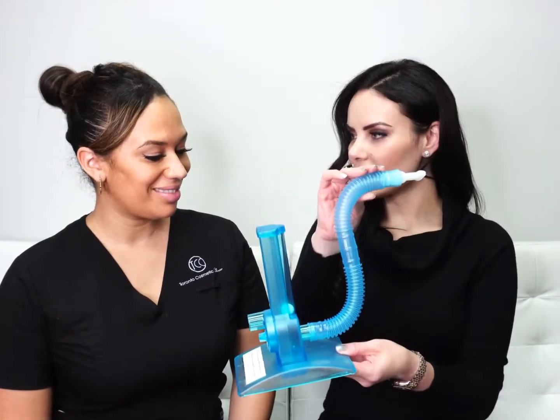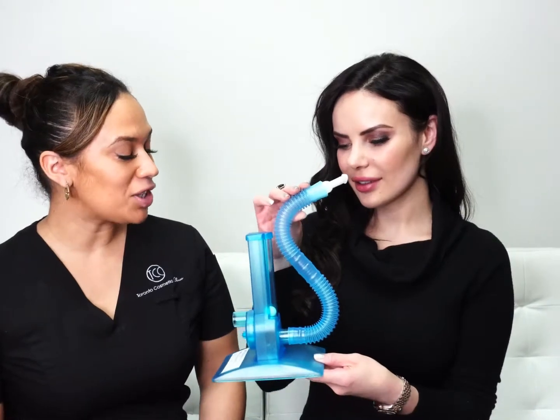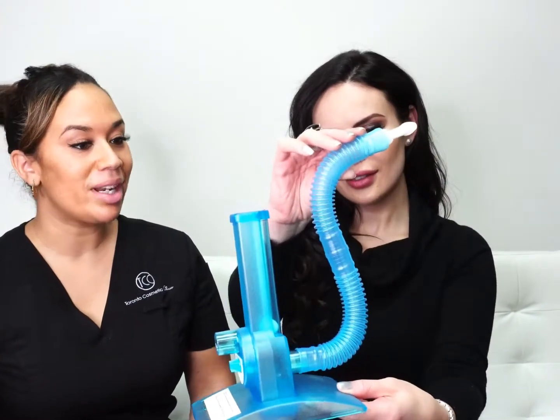So nurse Shannon, what is this? Is this one called a medical shisha? Yeah, it actually kind of looks like one. It's actually called an incentive spirometer, and what it does is it helps keep your lungs healthy after surgery and helps prevent many major complications such as pneumonia.